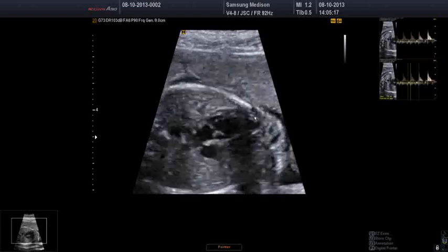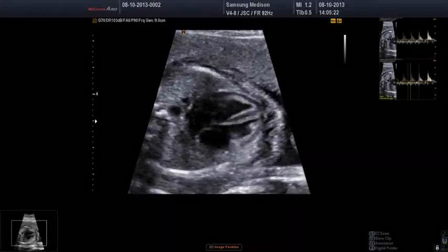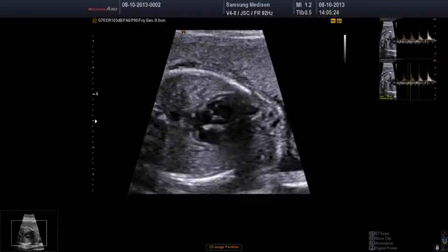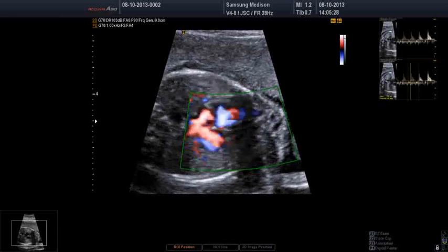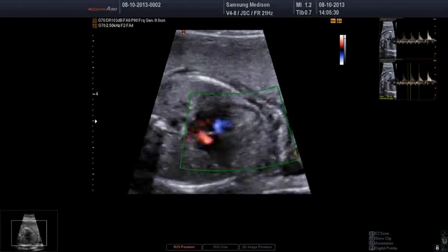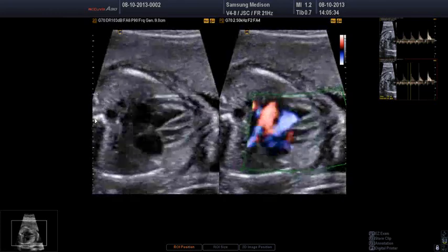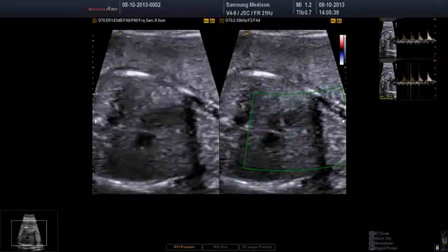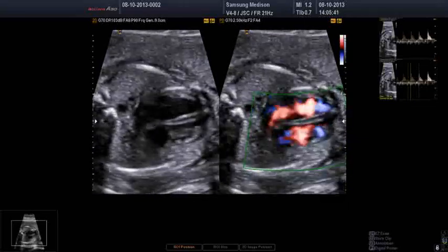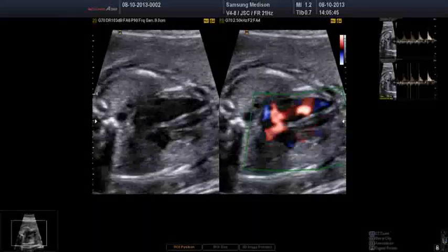So visually we have a good contractility of the heart. We kind of had an assessment of function. If we put our power Doppler, increase the velocity because it was quite low because I was looking at the pulmonary veins. And if we split the image again, it's a nice way of showing the ventricular septum. Go all the way down, scan to the back of the heart, you come anteriorly, you always adjust your hands to see the parts of the heart you're interested in.